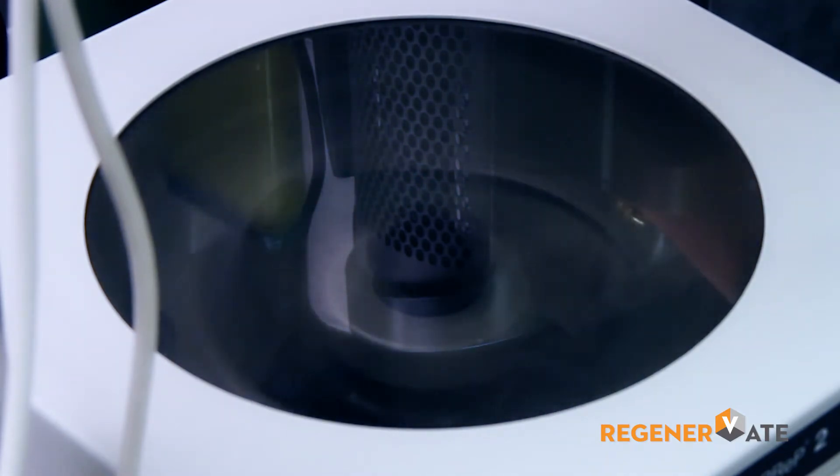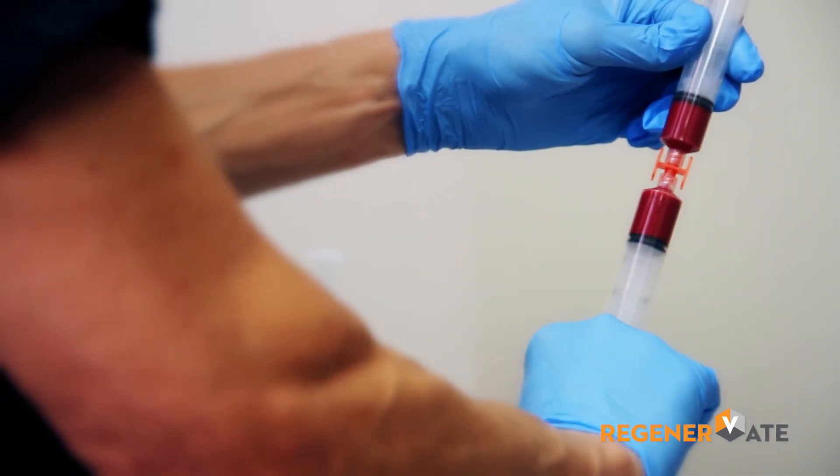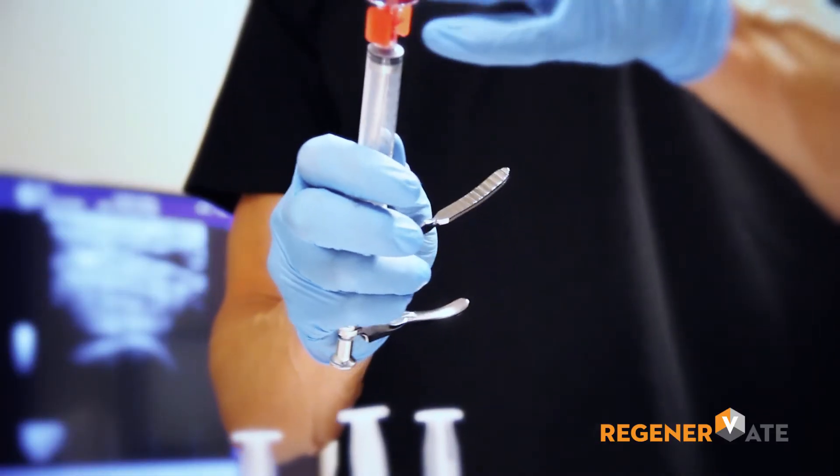Once the fat is separated, we then take the fat, mix it with the platelet-rich plasma, and ready the syringe for injection.